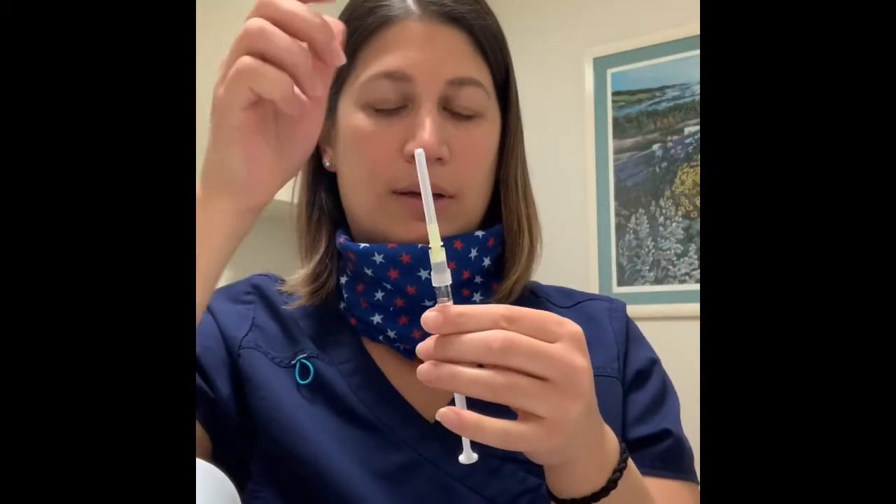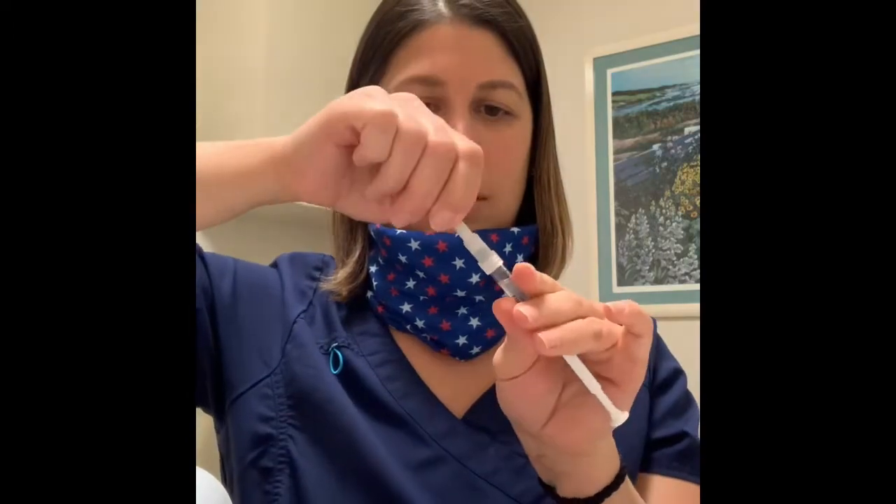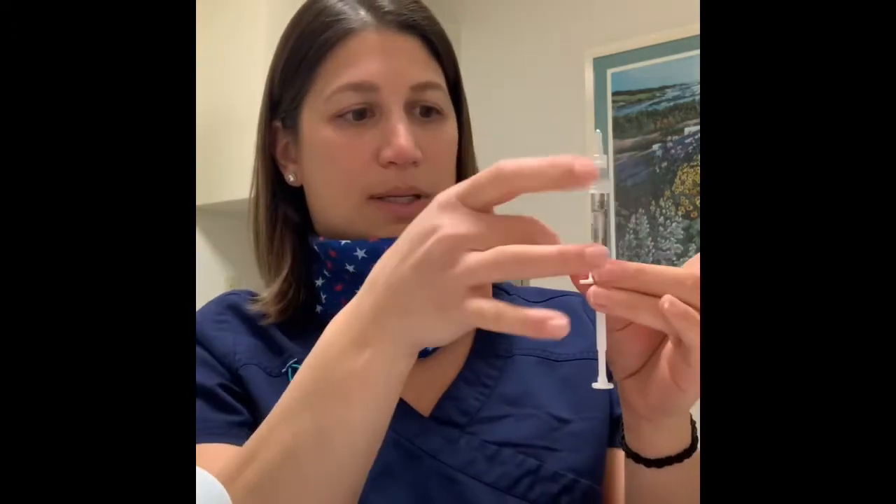Once you have all the medicine in the syringe, recap the yellow needle very carefully, twist it off, and throw it in the sharps container. Take the gray-hubbed needle, twist that one on, and take the safety off. If there are any air bubbles, flick them. Just remember to pull back a little, then push up until you have a small bead of fluid at the tip of the needle.